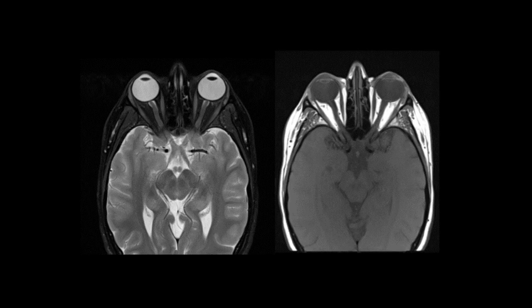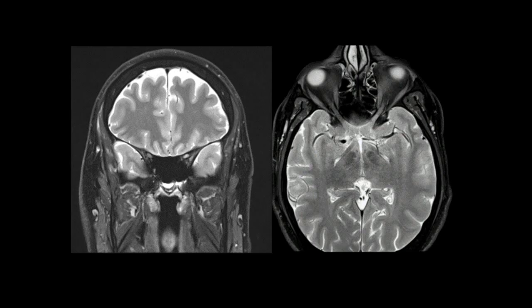Some things that are just impossible to do with human operators can be simple, like a triple oblique orbit to get the optic nerve in one shot can be very helpful. And this type of symmetrical positioning can be really critical in showing you that the left optic nerve, sorry, I can't point at it, has a little bit of hyperintensity just before the chiasm on the left-hand side compared to the right. And that'd be very hard to see or describe if you didn't have perfect positioning.